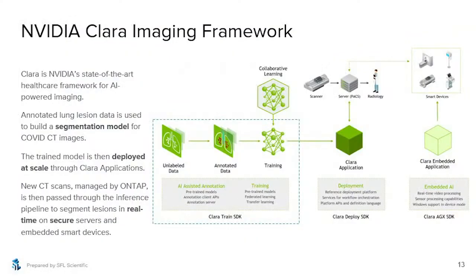It was my first project at NetApp. I loaded brain MRI slices with pre-trained models, annotated extra images for transfer learning, and fine-tuned the model on a DGX system. During these extraordinary times, Clara has released a fully pre-trained lung lesion segmentation model, which is perfect for our use case, as Igor just covered.